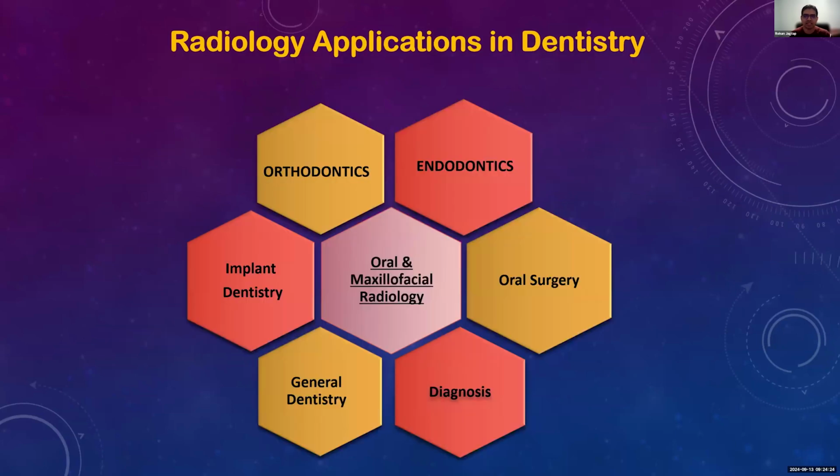As you can see on this slide, radiology really plays a central role in all the applications. In diagnosis, in day-to-day practice, you're diagnosing caries, periodontal bone loss, apical pathology. Oral surgery is doing surgical cases based on radiology; cone beam CT changed how we practice dentistry. Endodontics is using a lot of cone beam CT now. You must have seen endodontists taking CBCT a lot to know the root anatomy. Orthodontics uses a lot of CBCTs for treatment planning. Implant dentistry and general dentistry use 2D and 3D imaging day to day.